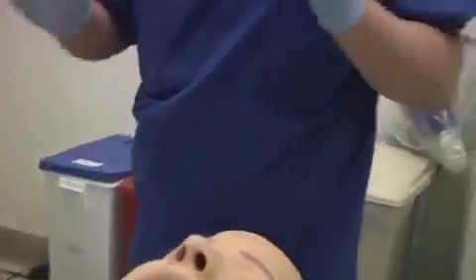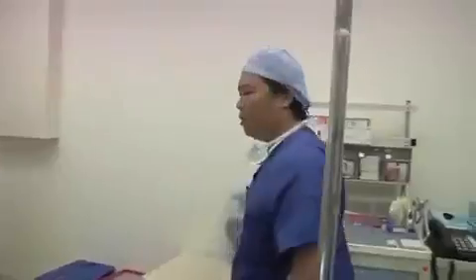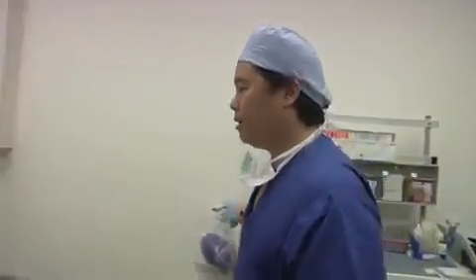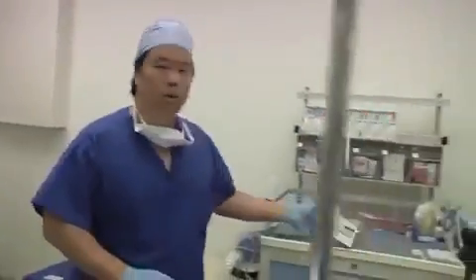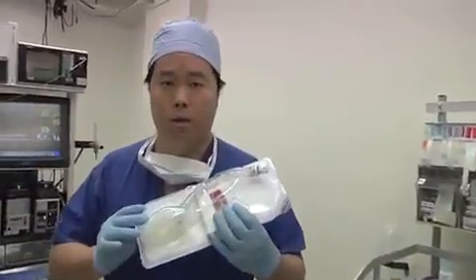And finally, just check the room one last time to make sure that you have all of your emergency equipment. So you want to always make sure that you know where your ambu bag is in case your anesthesia machine has a leak or you're somehow unable to ventilate the patient. You have an ambu bag that can assist you. And you also want to make sure that you have emergency airway equipment immediately available, such as a laryngeal mask airway.